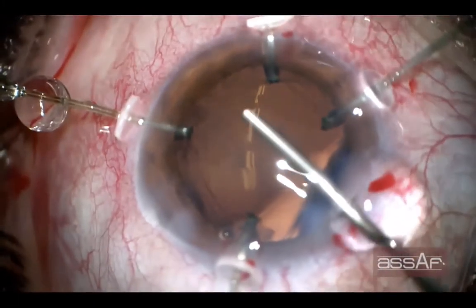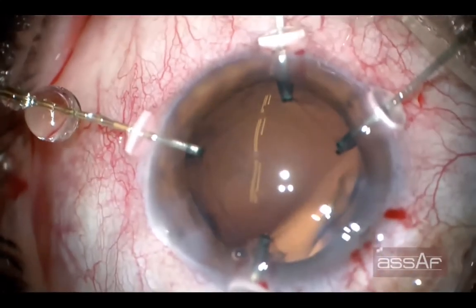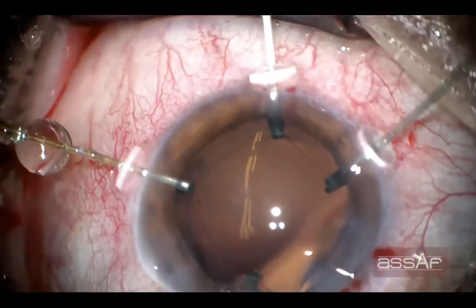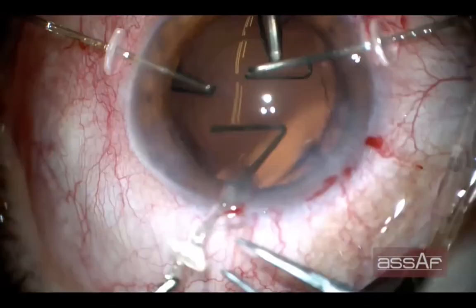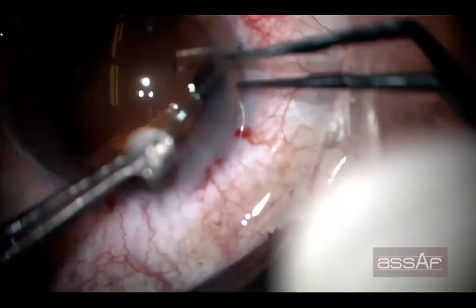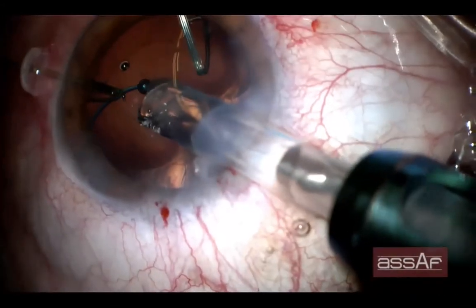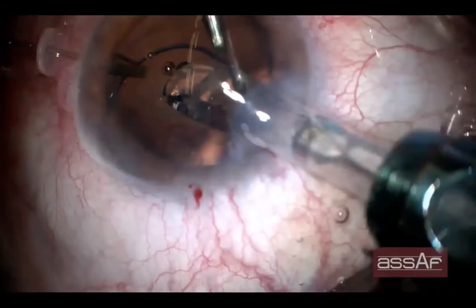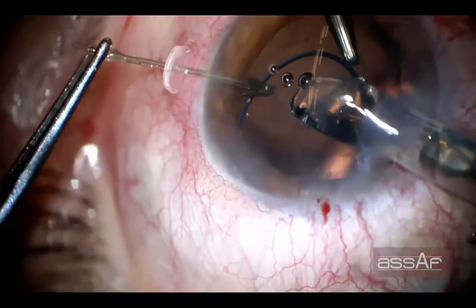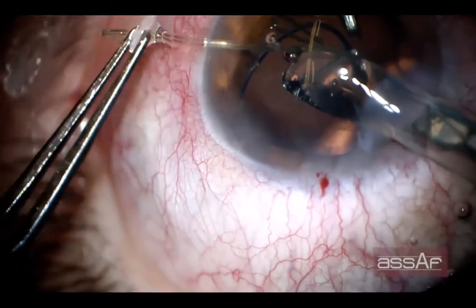However, in this case in particular, the capsule tension ring was not available in the OR, so this is a hard situation during a routine cataract surgery, and I'm going to show you how we can overcome this hard situation without implantation of the capsular tension ring. We can overcome this case of mild to moderate lens subluxation without a capsule tension ring by implantation of a 3-piece IOL in the sulcus.